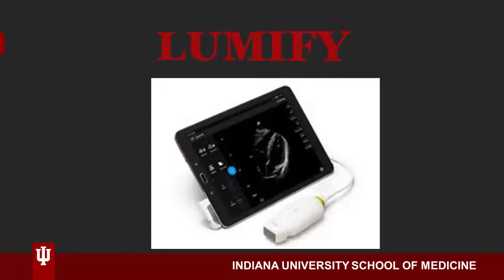I hope this intro video will help you better utilize the various functions of the Lumify point-of-care ultrasound device.